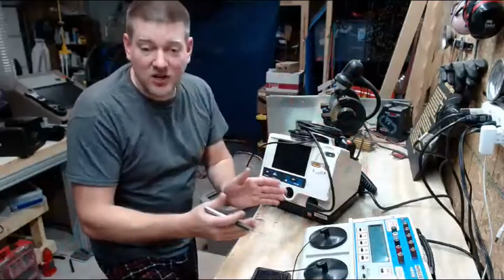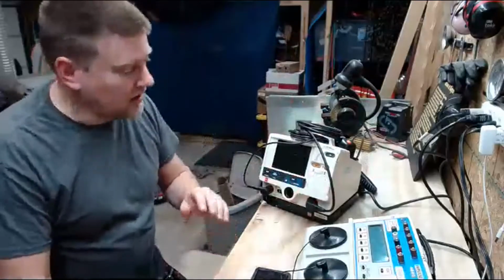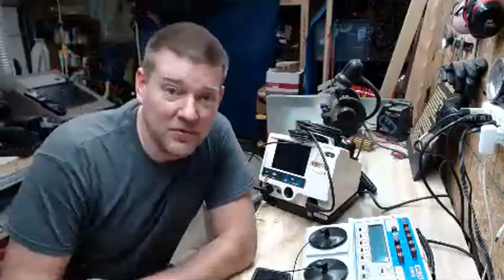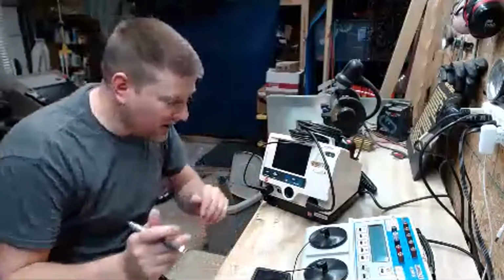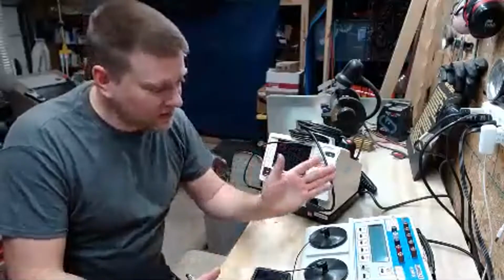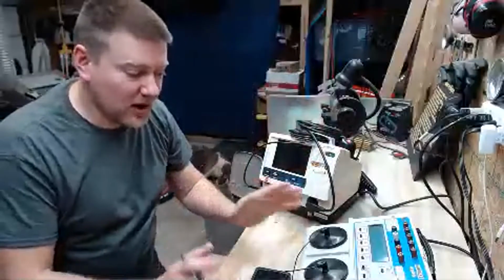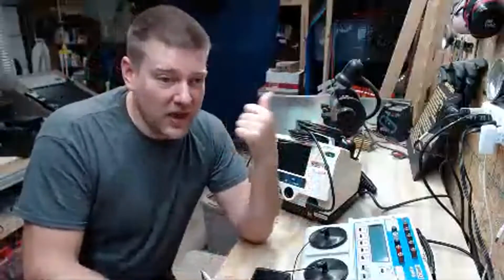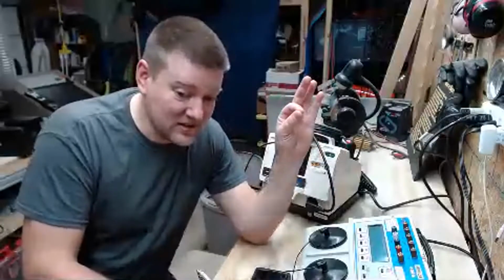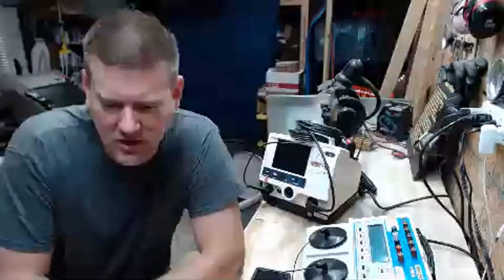Let the manufacturer send you back a report that says all the tests they did, whether or not it was good, and your work order. Let them do the work. Let them assume the liability. And I'm saying, defibs are just one of those things. If there's a patient incident involved, ship it out because you want the most correct statement. The manufacturer's trying to cover their ass too. They don't want the equipment to be defective, but if it is, they're going to take ownership for whatever defect it is. They're going to fix the defect, and they're going to give you a report. It's beautiful. What wouldn't you like?